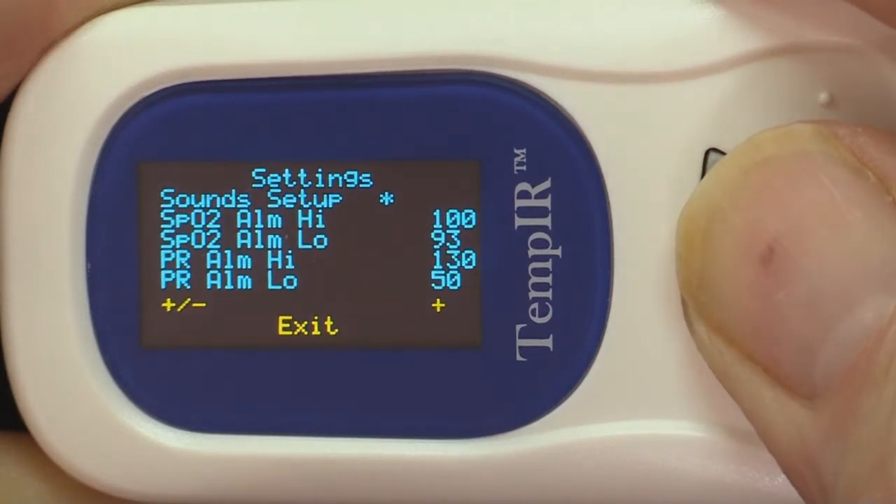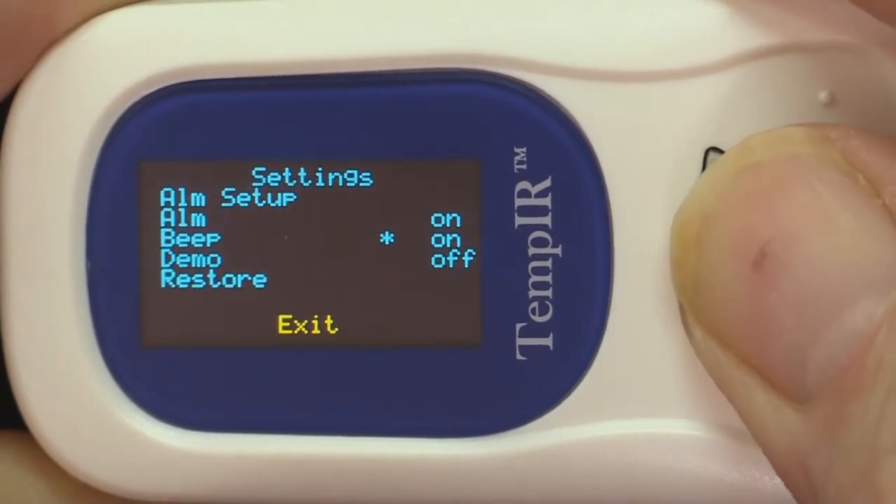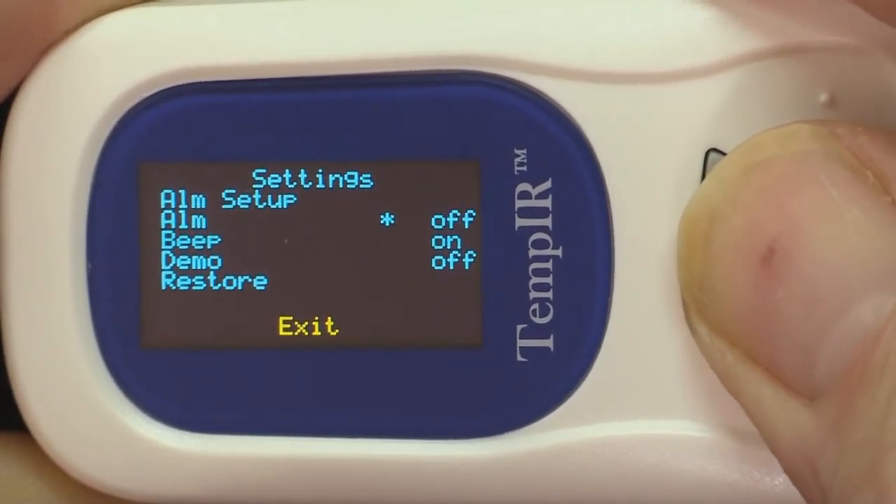To change between the menus apply a longer press. Once you have selected the menu you want to change, further short presses will cycle the cursor through the options. A longer press is required to change a setting.